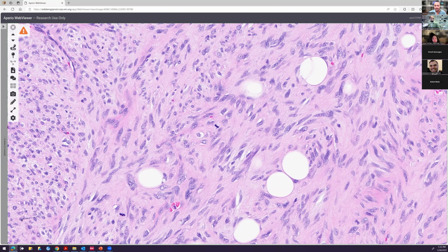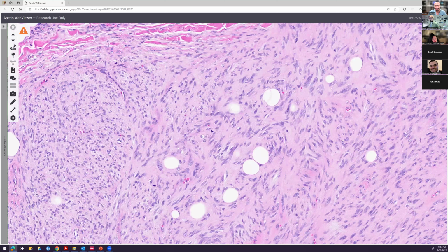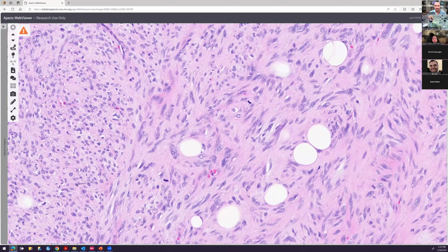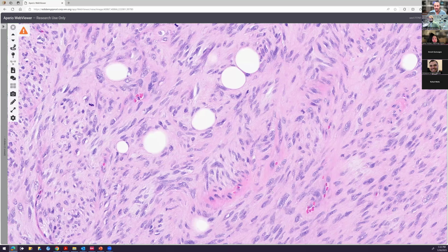That's true. So the cells tend to be more plump, more hypercellular, so even more cellularity close together, more plump. CD34 can be reduced or lost. It's just a bit of an iffy marker, to be honest. I've seen it in a number of DFSPs, and it's just not always a great thing to look for. But another good thing to keep in mind is mitotic figures. This one, for example, this area is a little bit fascicular, right? And the cells are a bit bigger and more plump.